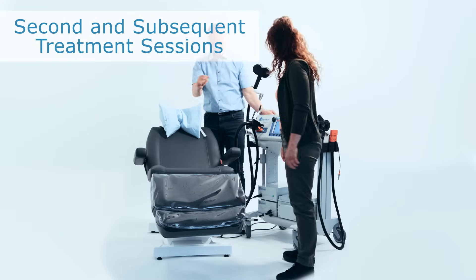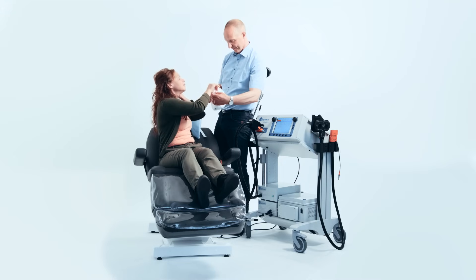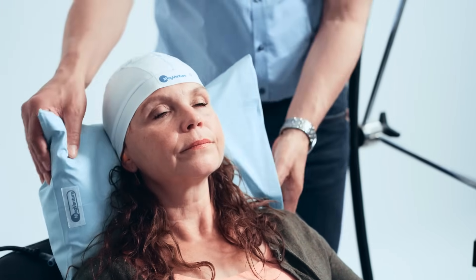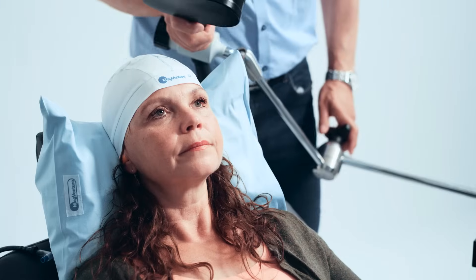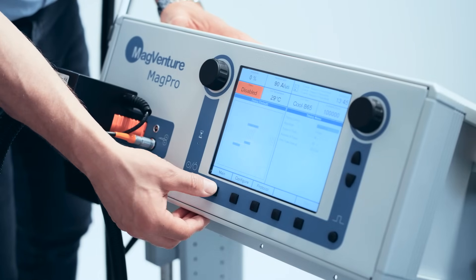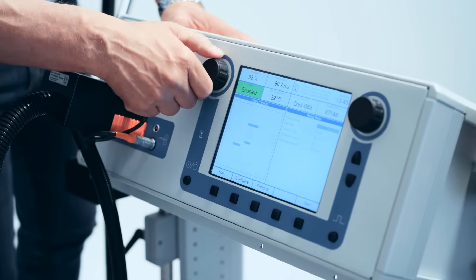When the patient returns for subsequent sessions, make sure to accurately reposition the cap in the same position it was during the initial session, making sure that the distance from the nasion to the edge of the cap is the same as noted from the first session. Make sure the cap is properly aligned with the midline. Once the cap is positioned correctly, prepare the patient for the treatment session. Place the treatment coil on the treatment location using the contoured line marked on the cap, just as was done during the first session. Ensure the proper protocol is loaded, navigate to the timing menu, enable the stimulator, set the intensity to 120% of the patient's motor threshold value, and initiate the RTMS session by pressing start.